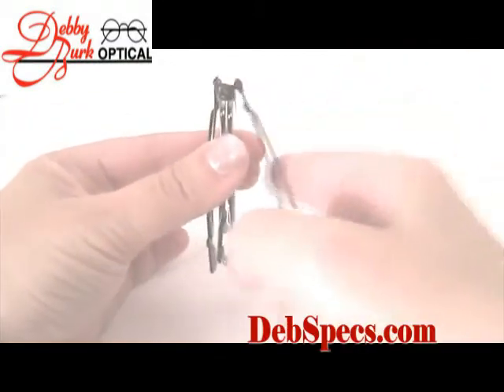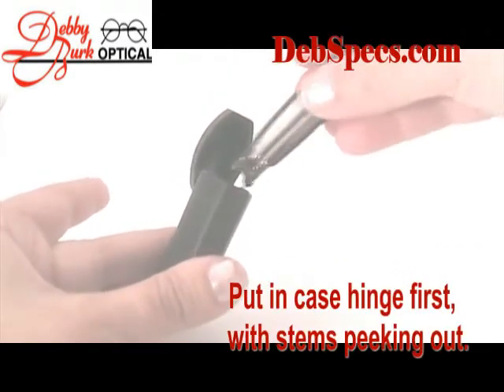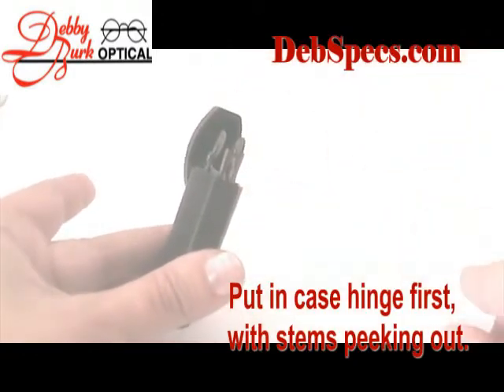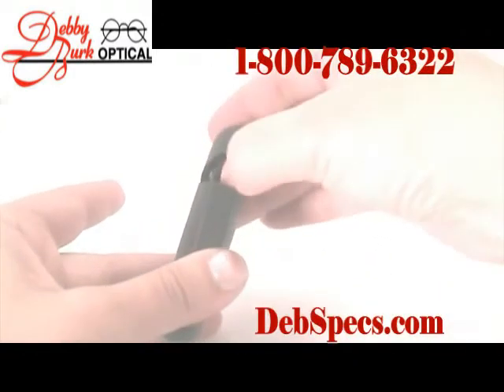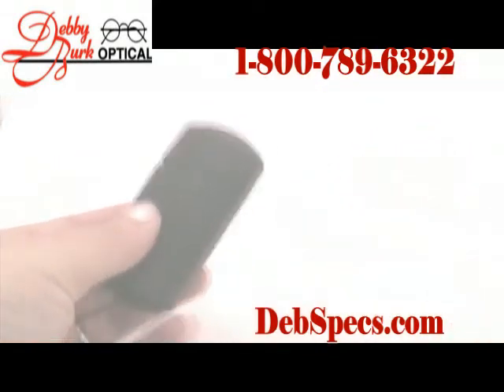Remember, the trick to these glasses is that the arms fold to the outside of the lenses. To get them into the case, push the glasses in hinge first, so that the stems are poking up on the outside.